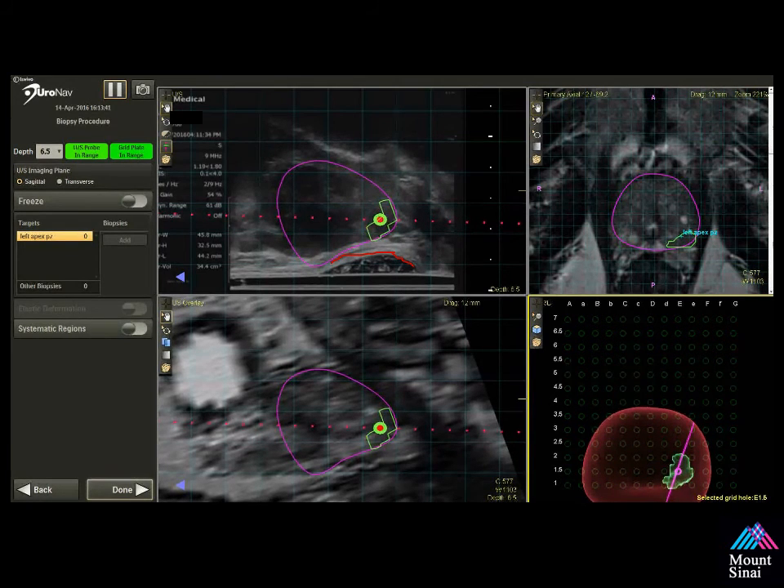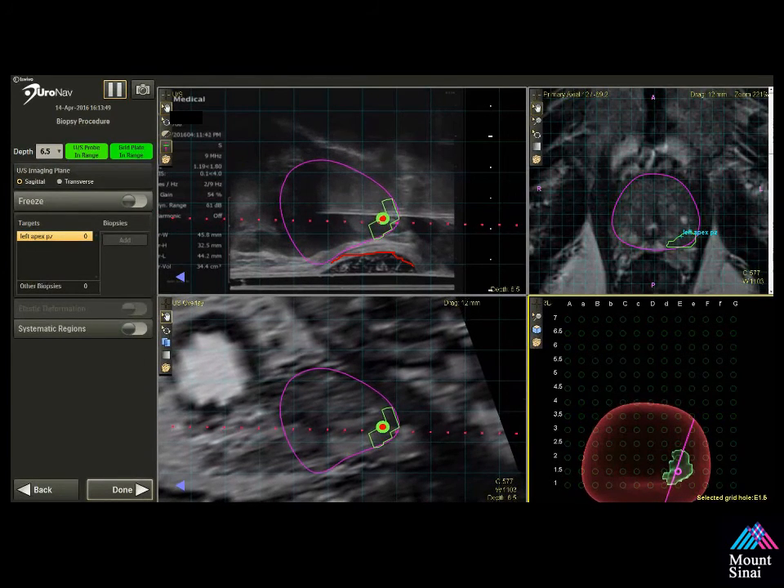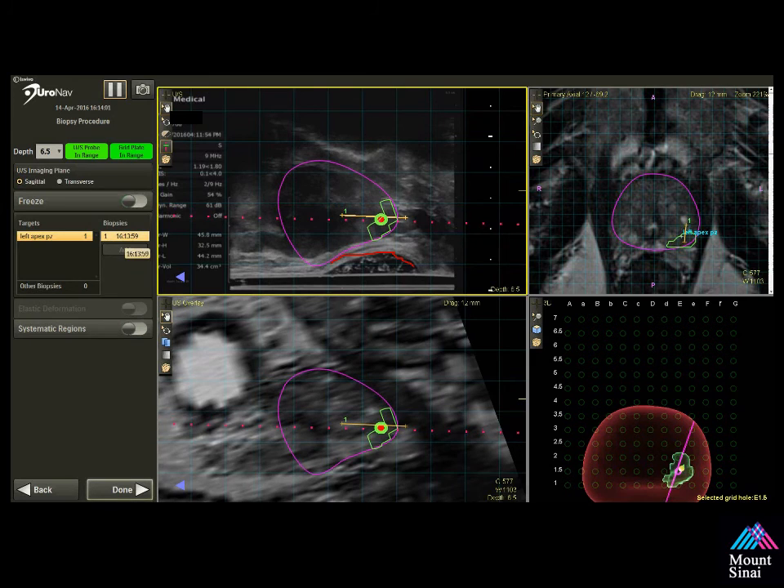Notice how the needle is beveled up. Please take into account the way the needle is beveled — you can angle it up or down during the procedure to get good alignment. Place the needle in front of the target, sample directly through the area, and then mark it. Sometimes when your tech marks it, it may not be exactly in the correct area — please remember this during the procedure. That's also why we videotape it. This data is then transferred back to Dynacad to be reviewed by your radiologist as well as yourself in the office, to confirm how well the biopsy was performed. Having that feedback loop is really key to ensure you do the best biopsy possible.